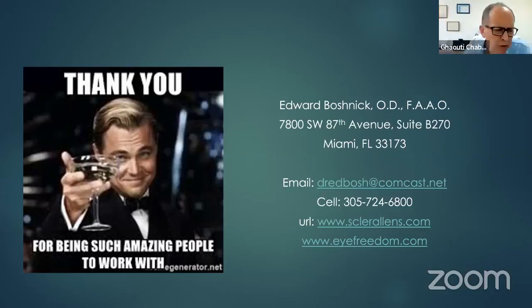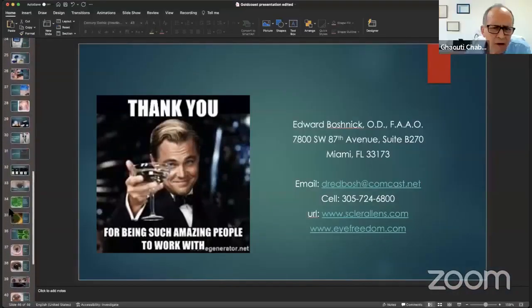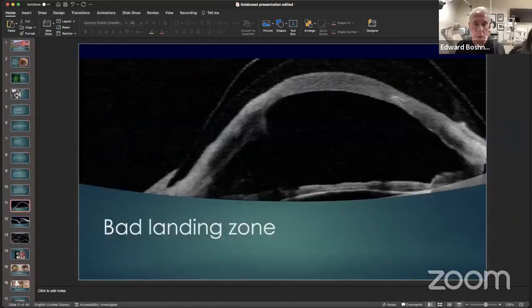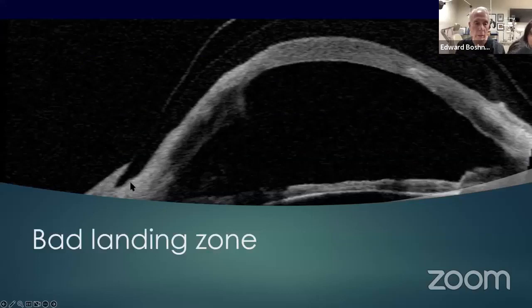One of your first slides, on the bad landing and good landing. Can you get back to me on that? One second, let me go to that. Yeah, you can see the edges digging into the sclera.